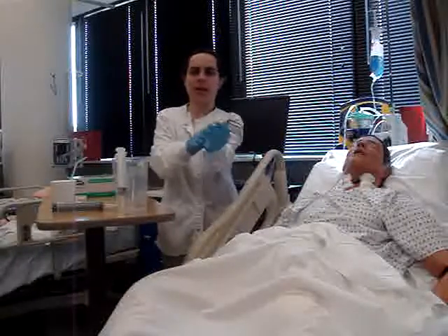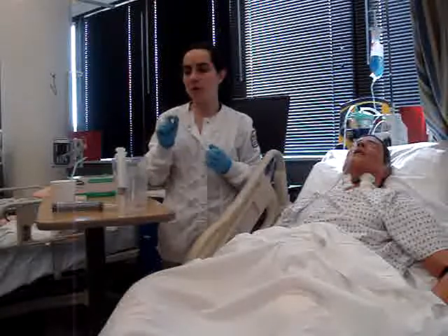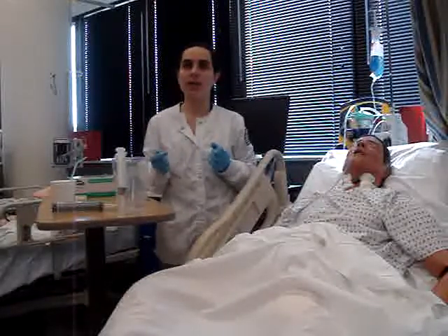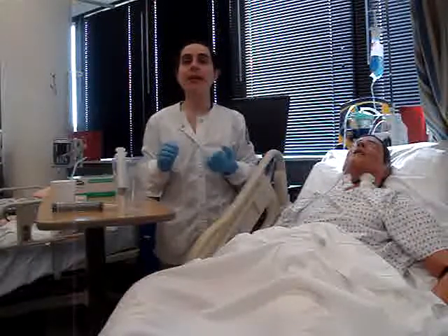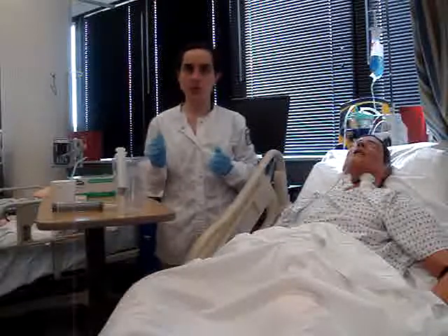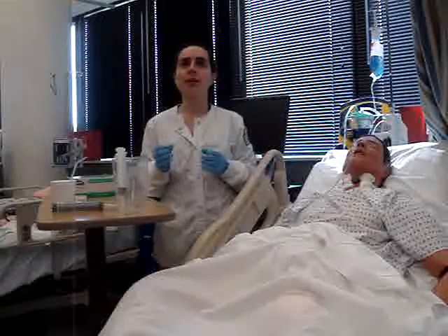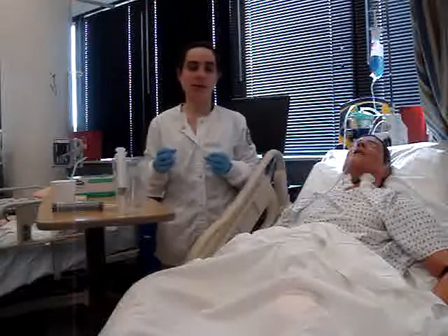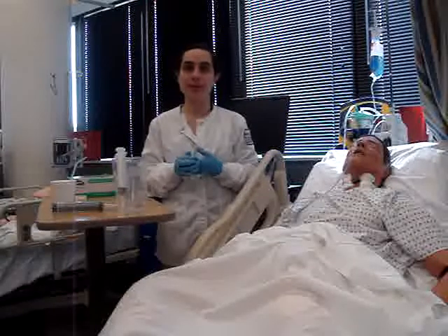And I can check the pH. I can flush with 30 milliliters of air, aspirate a small amount of stomach content and check the pH. I can also visualize the color and the consistency. I can aspirate all gastric content and measure the amount. And I will return it back to the patient's stomach or not, depending on what the facility policy says.